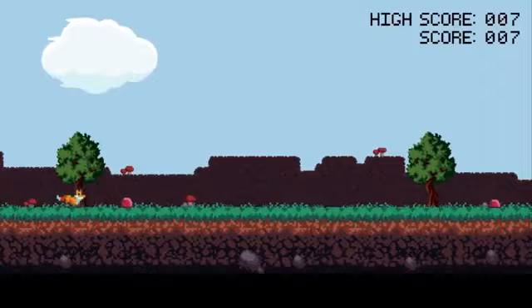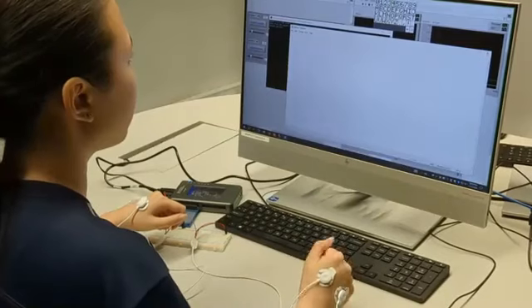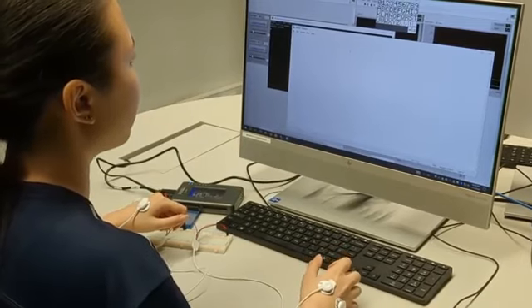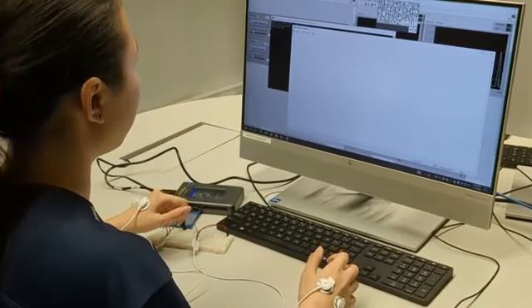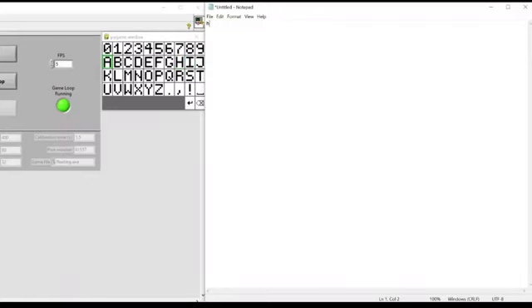Our device has been tested on specially designed single and quadruple input games targeted for the upper limbs. However, the device is not limited by placement or number of electrodes. This means our device can be easily adapted to be used on other areas of the body, as multi-input or multiplayer games, and even other purposes such as typing, due to the device's key binding abilities.